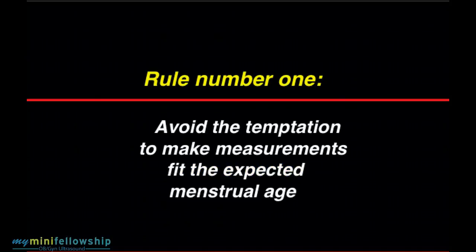So rule number one is we need to avoid the temptation to make measurements fit the expected menstrual age. I cannot tell you how important this is, and I don't know if I even need to explain to you what a temptation this represents. The obstetrical sonogram is not like any other diagnostic test that I know of.